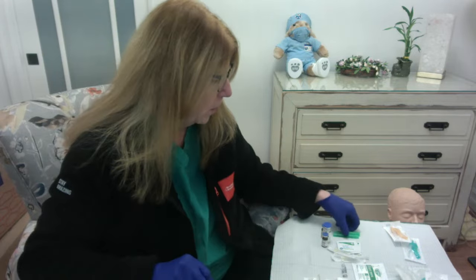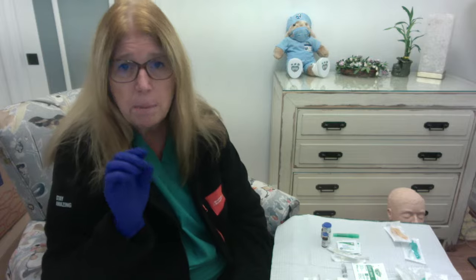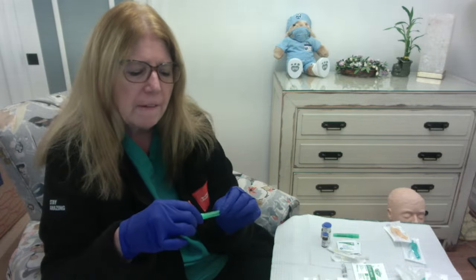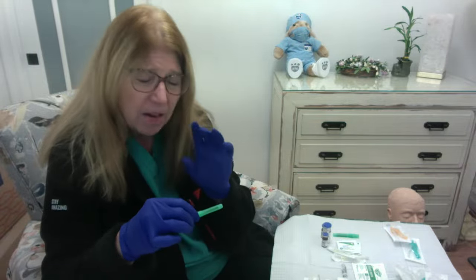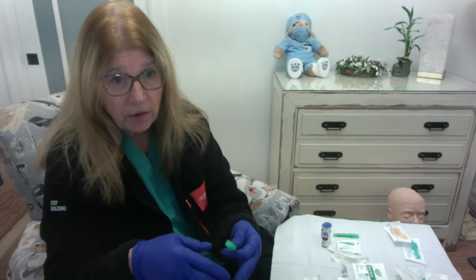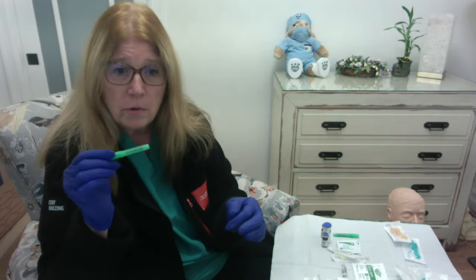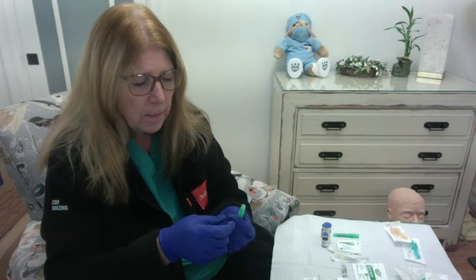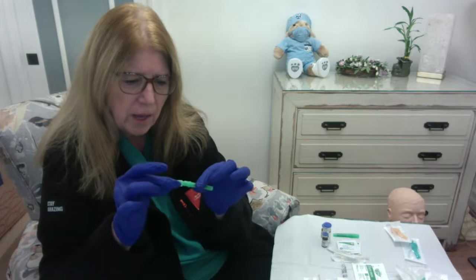I have to get the medication out of here. Now, when we're taking medication out of an ampule, you need to keep in mind that some very small pieces of glass that wouldn't be visible to the naked eye might be inside that liquid. So we need to use a special needle, which is called a filter needle. And filter needles cannot be used for injection. That should make sense to you, right? If I'm using a filter needle to get potentially little pieces of glass out of the ampule, I don't want to use this to inject into my patient. This is quite a large needle, okay, and essentially it has a cap on the end.